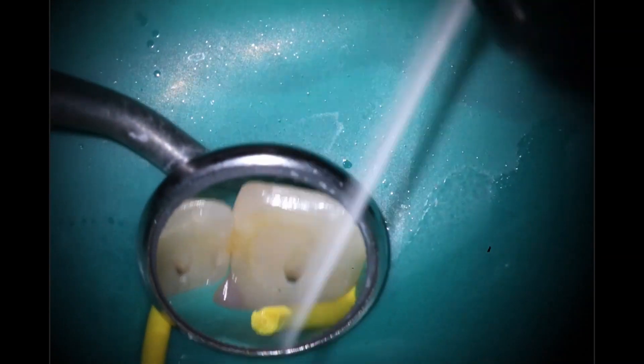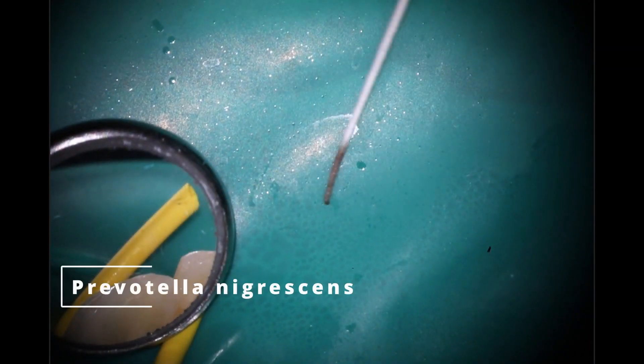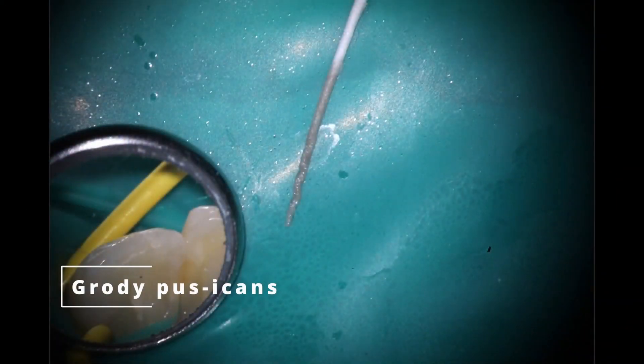I use this as a test. That activator kind of makes it so if there is still drainage, it'll actually activate the drainage as well and you'll start to see it coming through the tooth. So let's see if we're able to get this dry going in here with the micro suction again. It's looking pretty good. Sometimes you'll actually have a bunch of stuff come out there, but that does not look good. If you see that dark color on there, it's not going to be good.